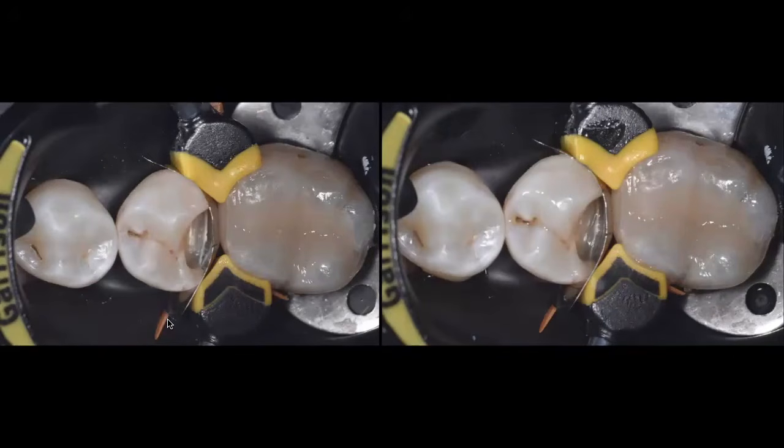That's why, again, I decided to do both of these back to back individually instead of doing them both at the same time. And again, it all depends on how good adaptation you think or you feel you have when you're doing these cases. And every single one of them is going to be different, as we all know.